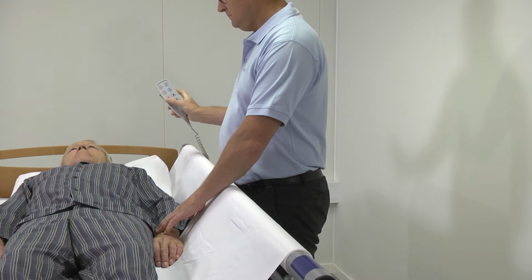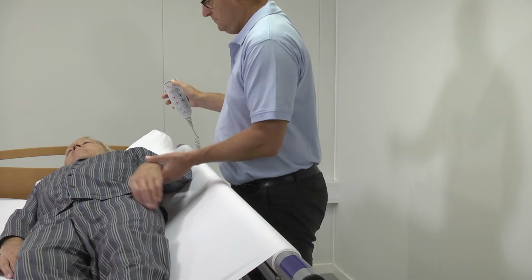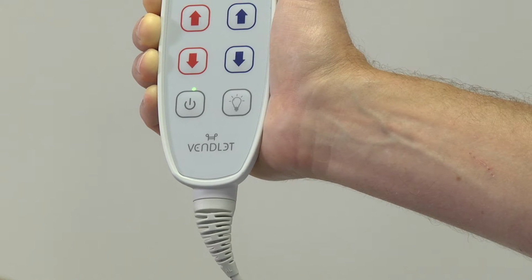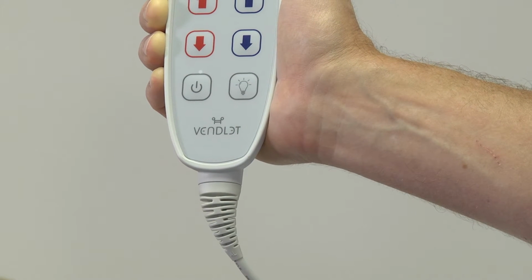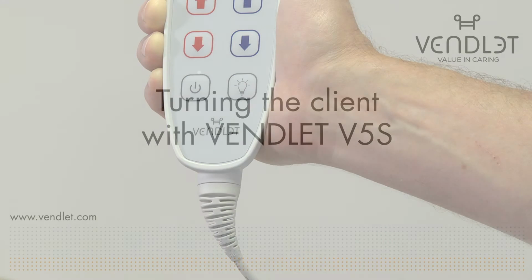To pull the sheet onto the bar, press the top button with the arrow which is turning outwards. To slacken the sheet, press the button with the arrow which is turning inwards. When VENDLET V5S has been inactive for 90 seconds, the system produces a beep-beep sound. The diode is turned off and the VENDLET system is deactivated.